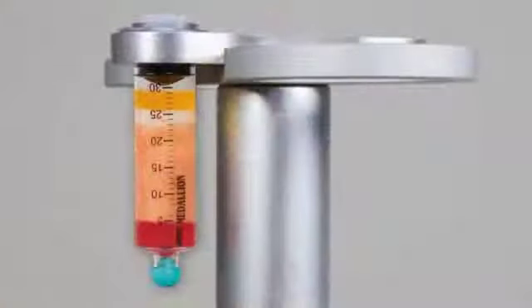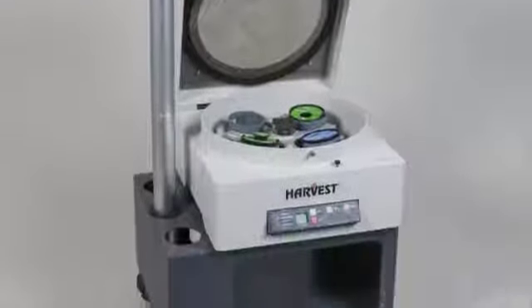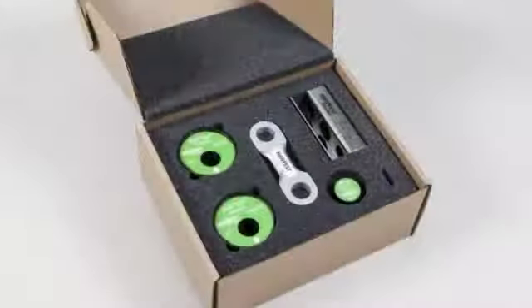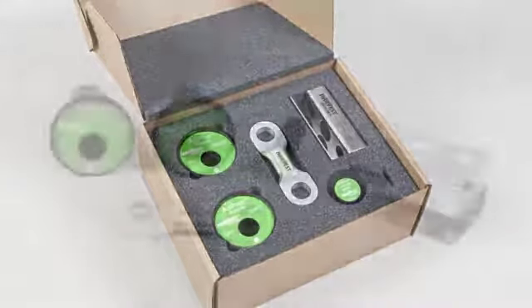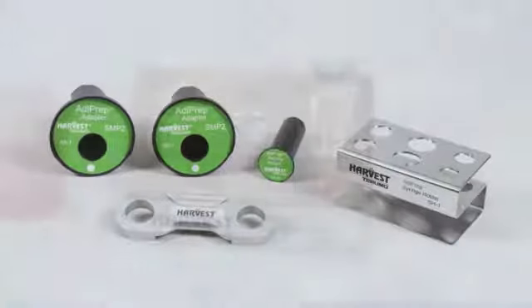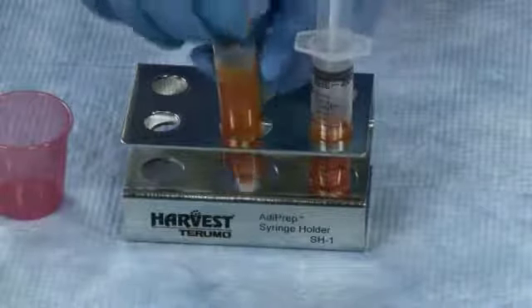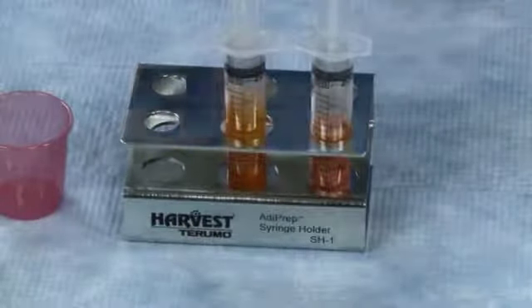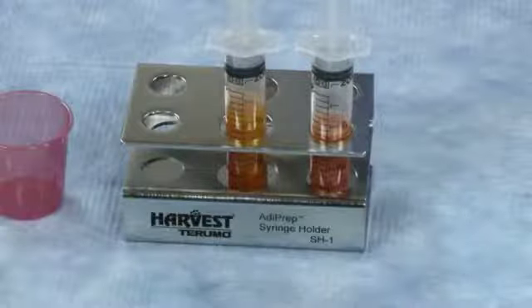The materials required for isolation of concentrated adipose tissue from a sample of lipoaspirate are a microprocessor-controlled SmartPrep centrifuge system, an AdiPrep centrifuge adapter kit. This kit contains centrifuge adapters and a balance weight to enable processing of the AdiPrep process disposable in the SmartPrep system. A convenient syringe stand designed for use during AdiPrep processing is included. The syringe stand is not packaged sterile and should be autoclaved prior to use.